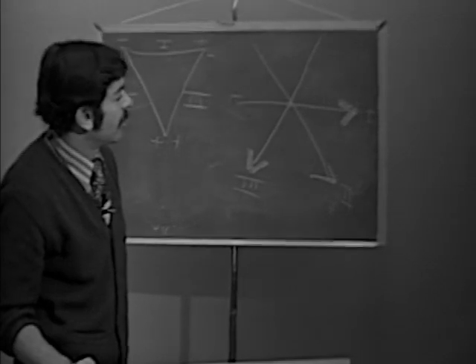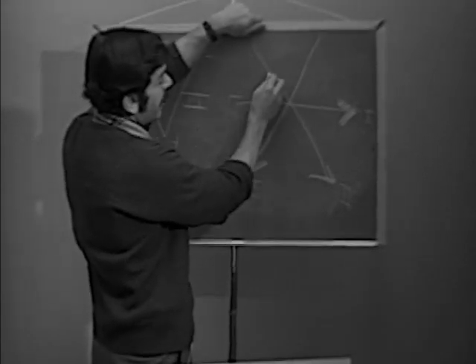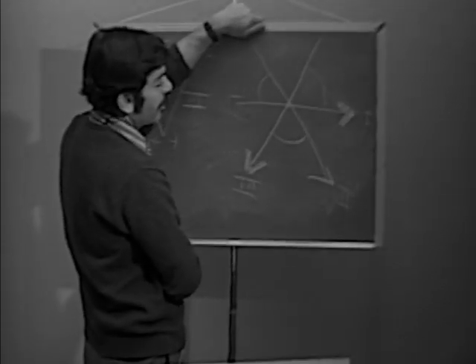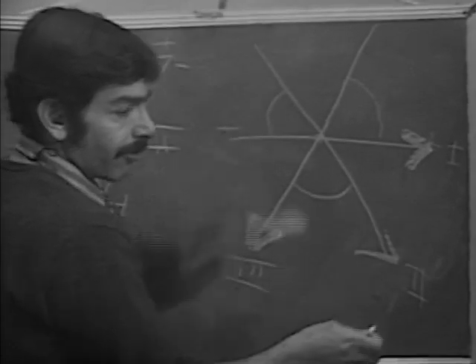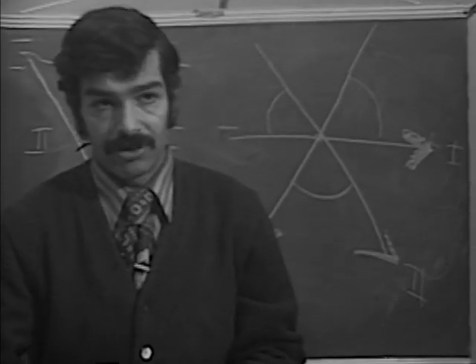Now let's figure out where the unipolar leads are going. Okay, the unipolar leads bisect these angles. And they're easy to remember because they tell you where they're going. AVR goes to the right arm. AVL goes to the left arm, L for left, and AVF, F, means goes to foot, right?